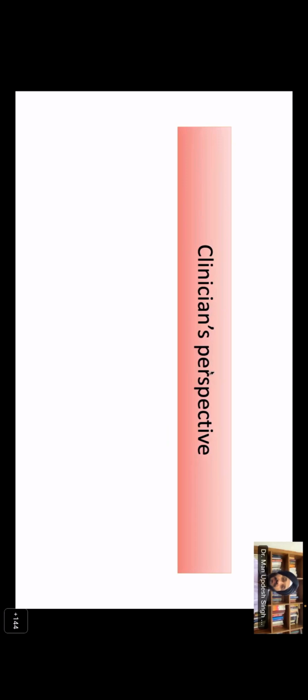Like you cross a tunnel in the mountain, you are still probably not soiling yourself with mud. The cell traversing through a cell forms a tunnel and does not touch the cytoplasmic contents. It passes through most of the megakaryocytes, and sometimes the histiocytes in some pathological scenarios will show emperipolesis. So that is how I'll put that. They are biologically different things.